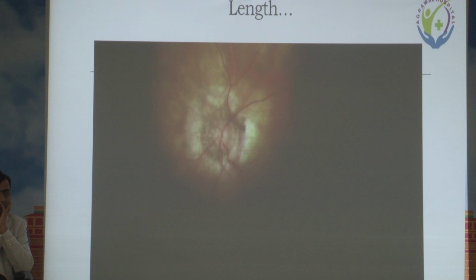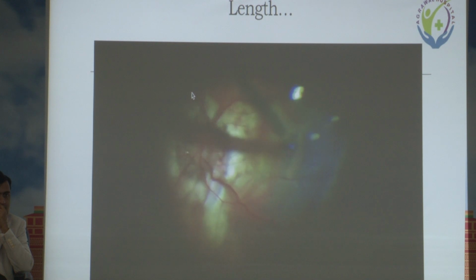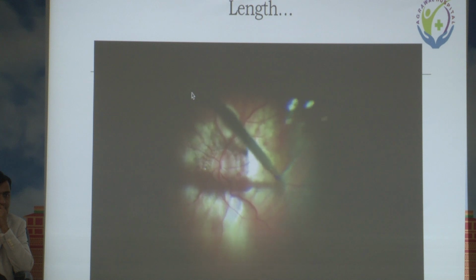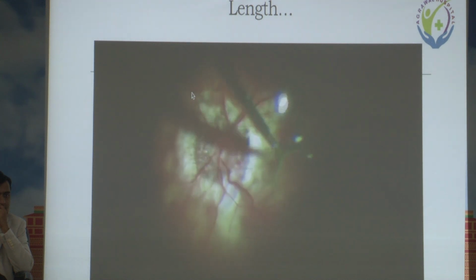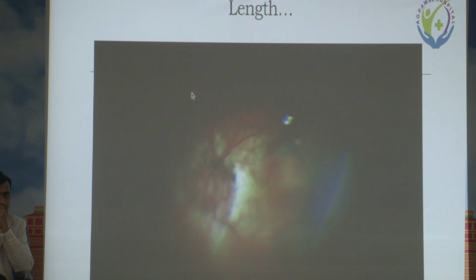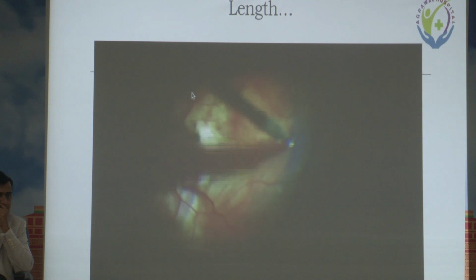Of course, in patients having 29 mm or less axial length, you can use the non-contact wide angle system. The other way around is you can make your ports more posterior, around 4.5 mm. You can remove the cannula, or you can use your left hand if you're ambidextrous, because your left hand might reach the posterior pole better than the right hand in these cases.